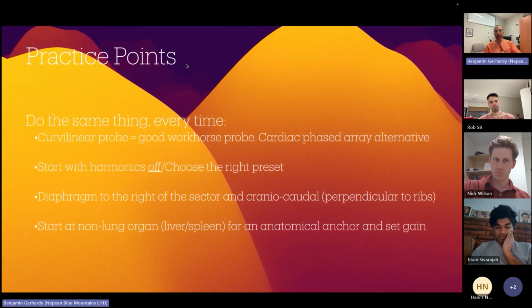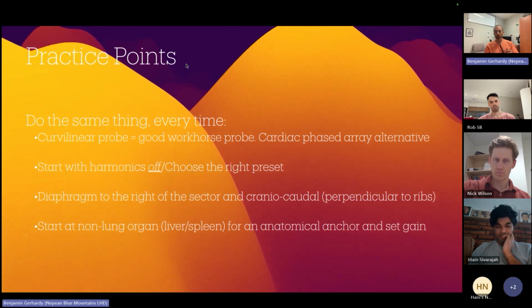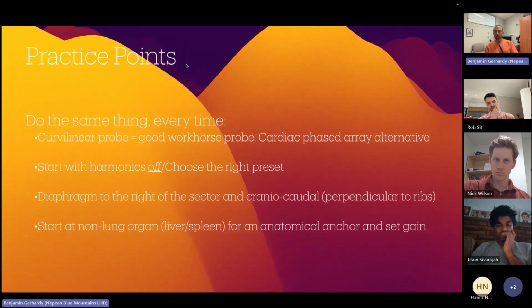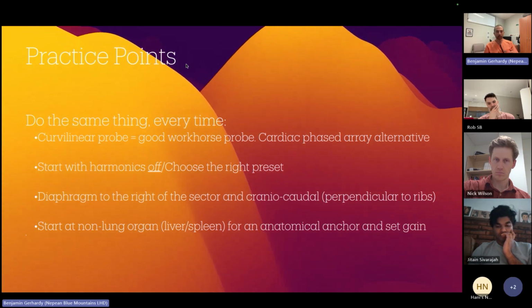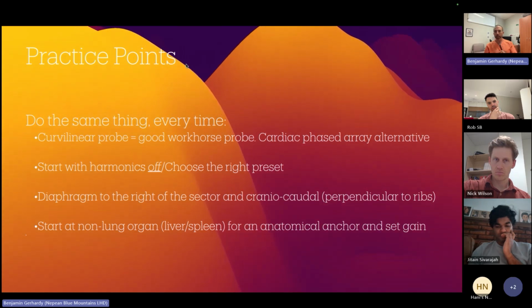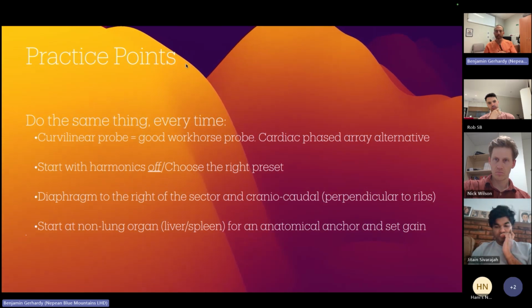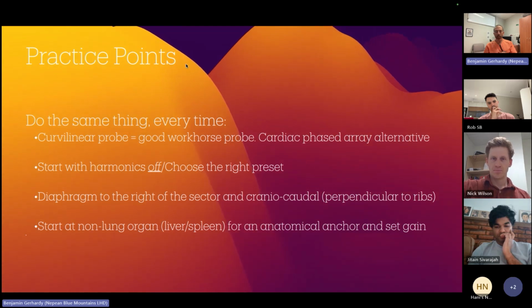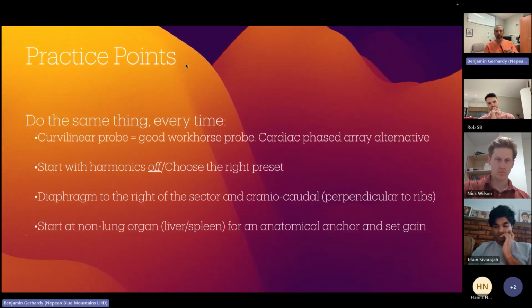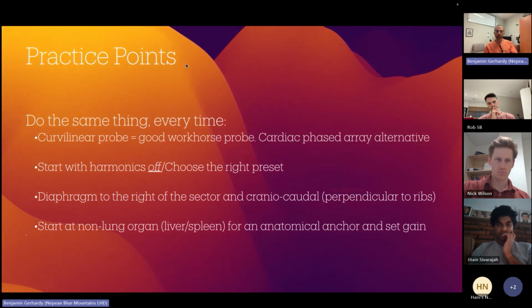And then you can pan up, have the ultrasound probe in a craniocaudal plane, and go up from there or go around from there. Trying to start with the ultrasound, especially if you haven't done much lung ultrasound before, trying to start in a plane that is more of an AP plane can be quite hard to get your head around, just the 3D anatomy, because you can just slip up and down a little bit, and then all of a sudden you're catching some diaphragm as the person exhales in the far field, things like that. So if you go craniocaudal and then pan through and around and move from there, generally it's much easier to get your head around to start with.